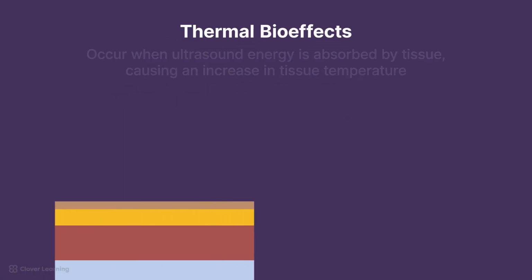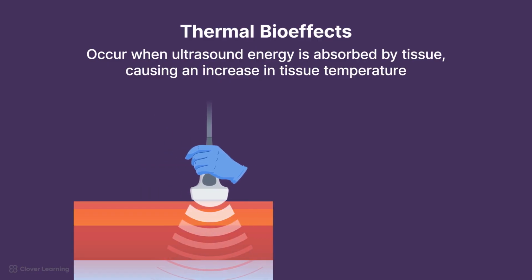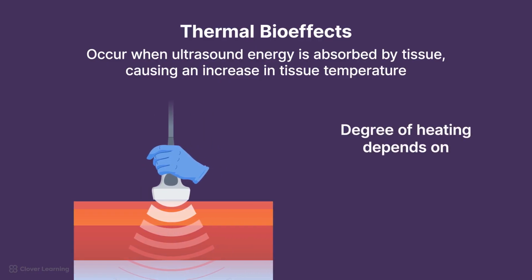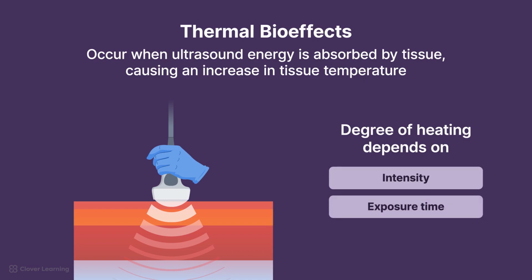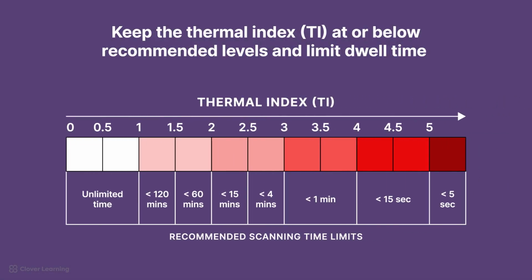Thermal bioeffects occur when ultrasound energy is absorbed by tissue, causing an increase in tissue temperature. The degree of heating depends on intensity, exposure time, and tissue properties. For instance, bone absorbs more heat than soft tissue. Therefore, sonographers must be diligent in keeping the thermal index, or TI, at or below recommended levels while performing sonographic imaging. Sonographers must also be mindful of limiting the dwell time, or the time that the transducer remains in any one spot on the patient's body.